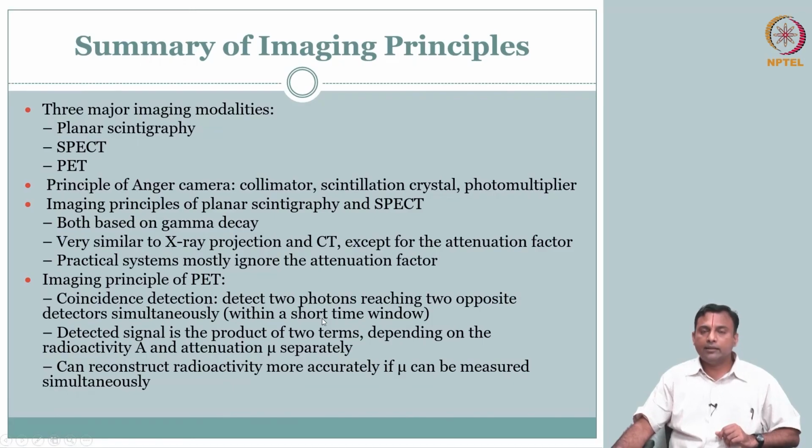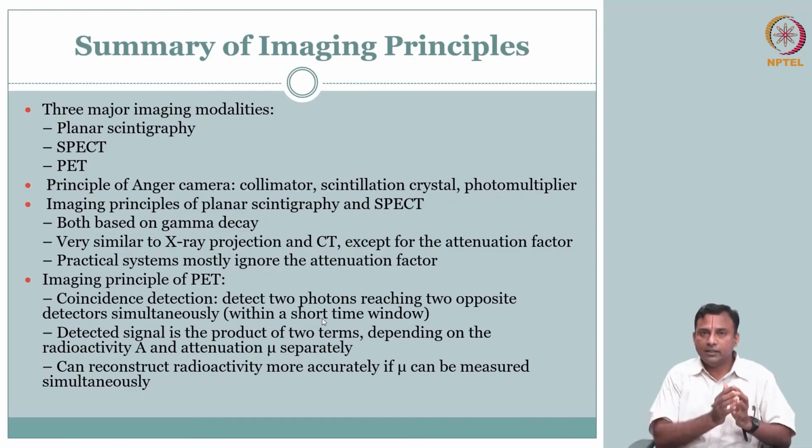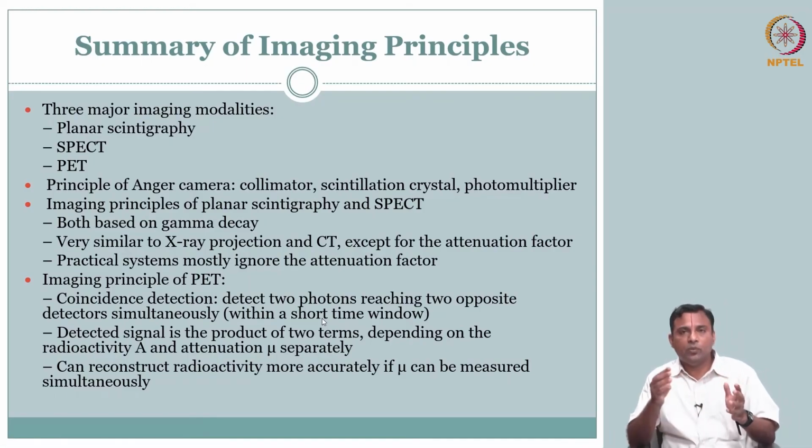Okay. So, I think this provides a reasonable introduction material on nuclear medicine and what is the physics, what is the instrumentation, what is the image reconstruction and what is the image quality. As you would notice, if you covered the first part, the recon in X-ray and physics in X-ray, from there to nuclear medicine we highlighted only the key differentiating aspects.